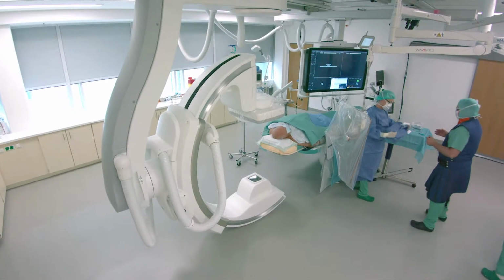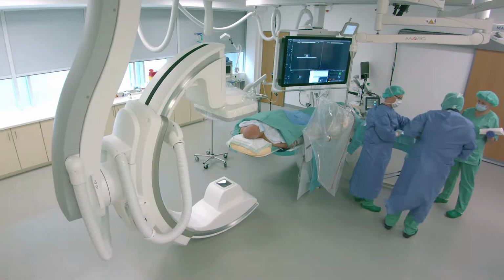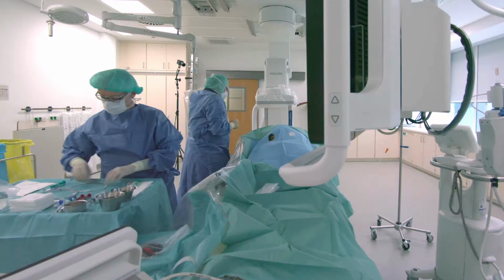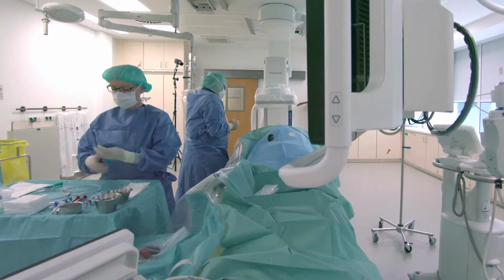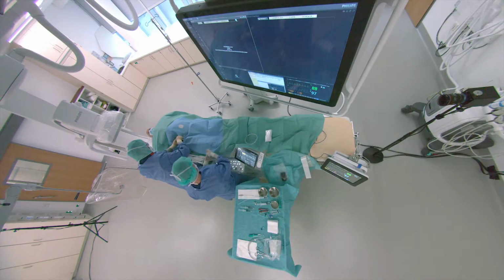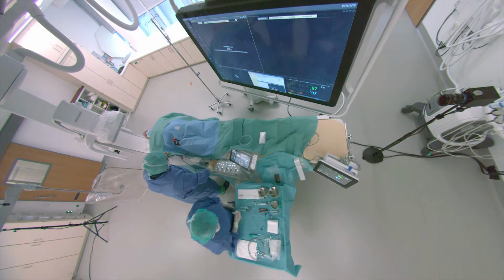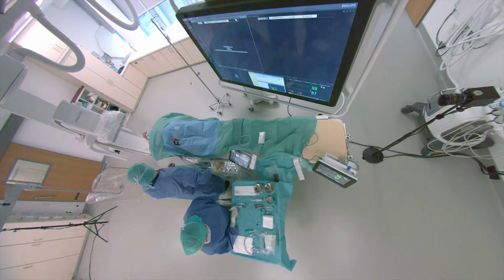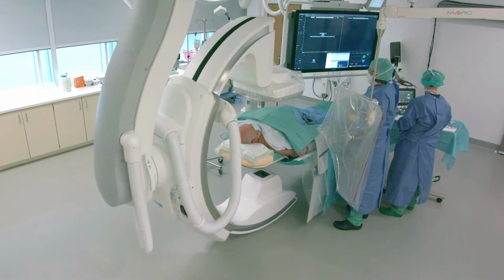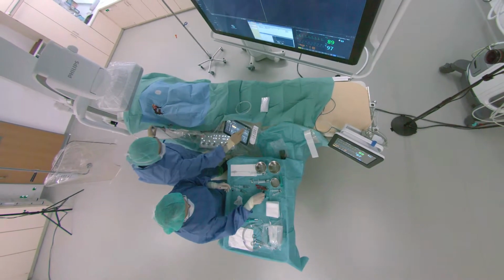When all preparations have been done by the scrub nurse, the interventional radiologist scrubs in. The radiologist starts the procedure by explaining to the patient what will happen in the next minutes of the procedure. Once the introducer needle is in place, a short guide wire is advanced into the needle, and the system is brought into working position. Here you see the C-arm can reach the groin in propeller position, due to the positioning of the patient as high as possible on the table.